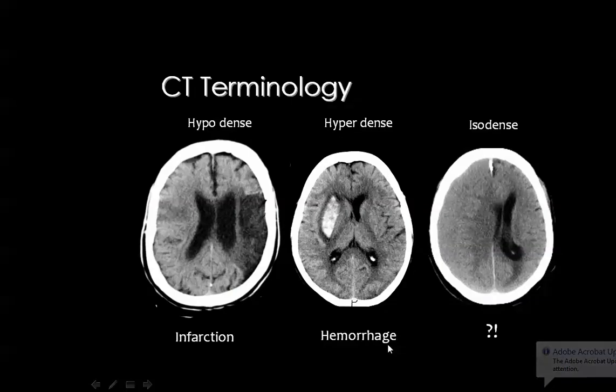And before we start, we have to emphasize some of the terminologies that we usually use while discussing this issue. And this is actually for the junior staff in order to set up some of the facts before starting or going deep into this subject. Whenever we are dealing with the CT scan without intravenous contrast injection, we use these three terms.